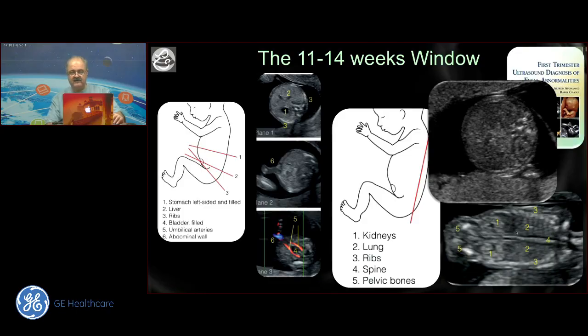Very often, the kidneys might stand out much more in a posterior coronal section of the fetus, in which you might see most of the ribs, part of the spine, and then these 2 echogenic areas at the back, which appear fairly bulky, and those are the kidneys. Remember you're on the right plane if you're seeing the iliac wings, and then you won't mistake these. Usually the reniform shape stands out so well that you will know this is a kidney, and you don't really require any clues beyond that.